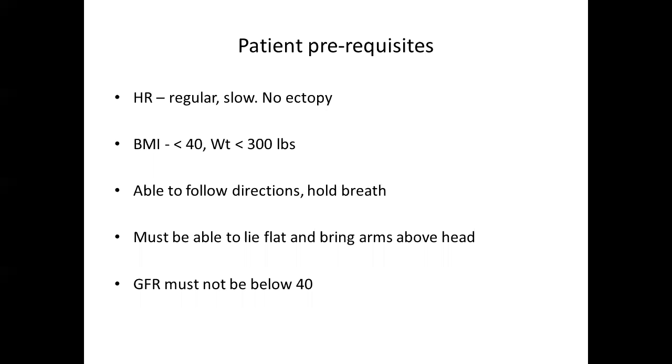Okay. And this is important. GFR of 40 is sort of a cutoff. Sometimes we will get requests like, patient has CKD, we don't want to cath him, so we'll do a CT. Bad idea. For CT, you have to give about 100 cc's of contrast, because you're giving it intravenous, not into a coronary. And with cath, as you guys know, you can get away with like 20, 30 cc with biplane. So CKD patients, just cath them.